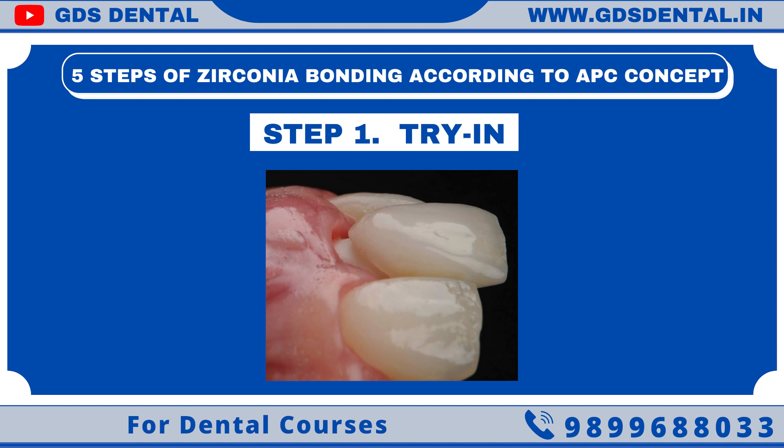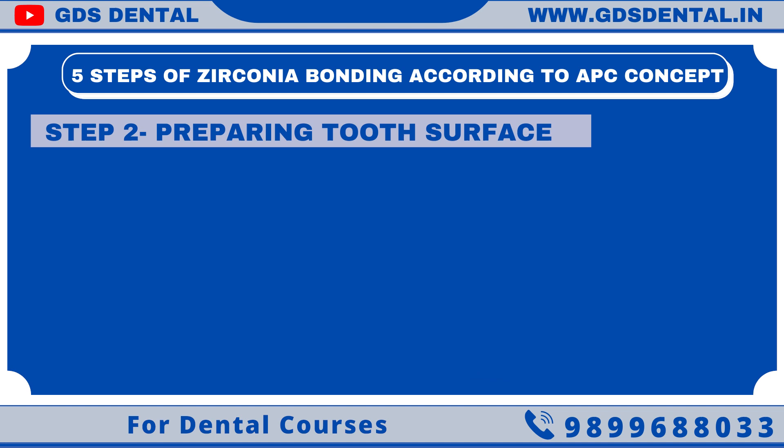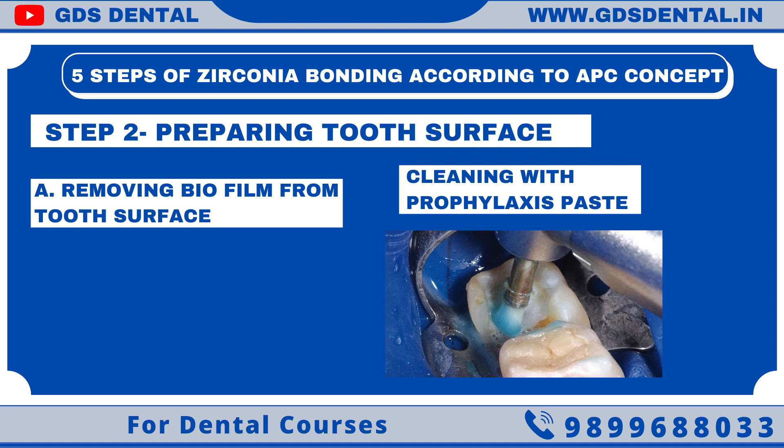Step 1: Checking the fit, aesthetics, and occlusion of the zirconia restoration. Step 2: Preparing the tooth surface. In order to have the best result, the tooth surface should be biofilm-free. I use my scaler to clean the surface, then we can use a prophy paste to remove all biofilm.